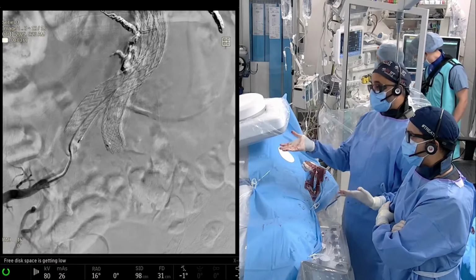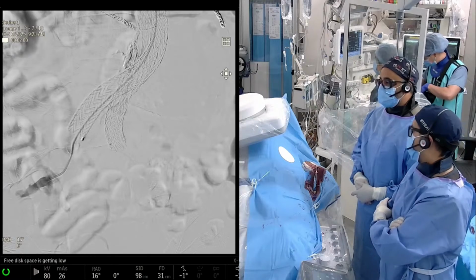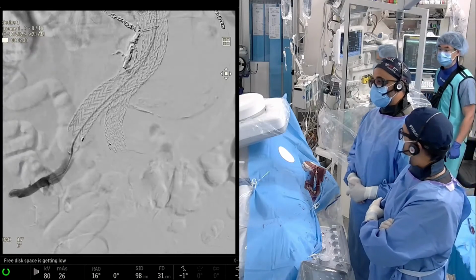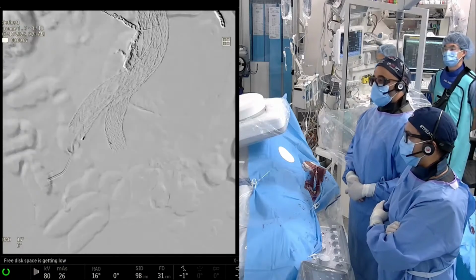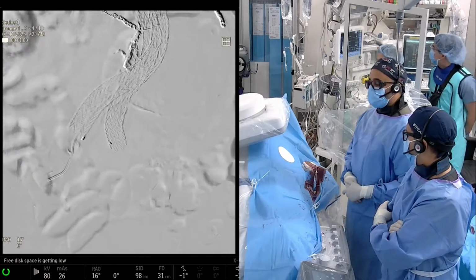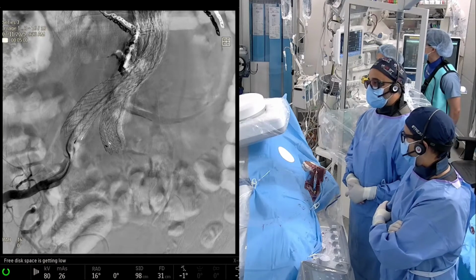So the problem here is that it's an 8. If I were going to put an Amplatzer plug, you've got to upsize, right? They recommend a 30 to 50% oversize, which means I have to put like a 10 or a 12 in there. Then I have to switch to a 5 or 6 French guide, which, in terms of length, we would need all of it. We would need a 120 guide to get there. So you could use a 119 R2P sheath and do it through that.